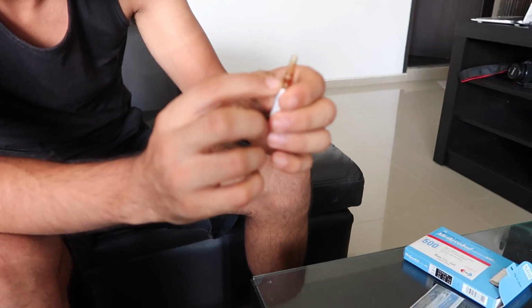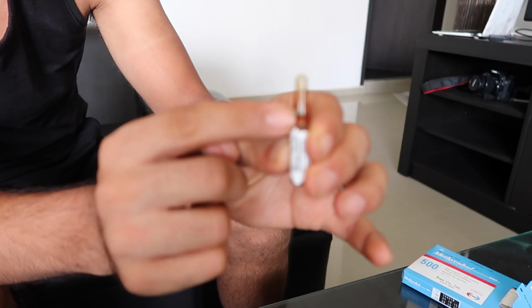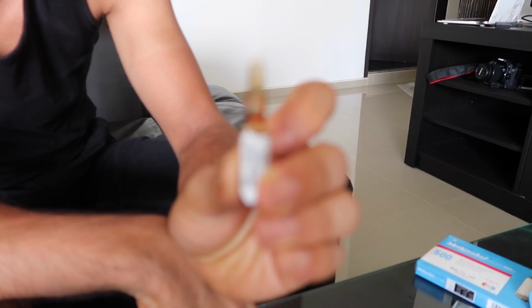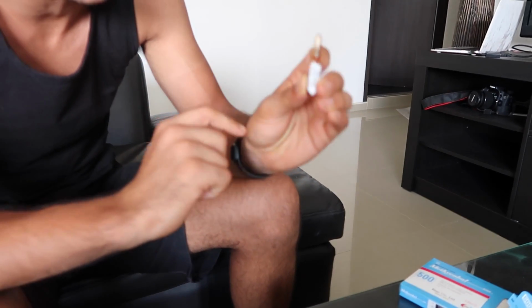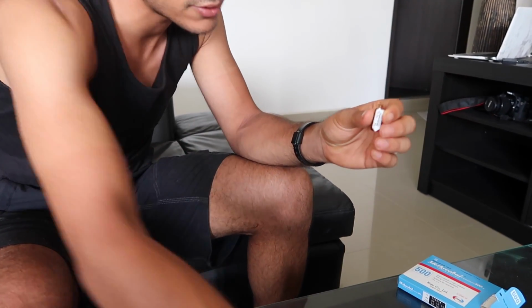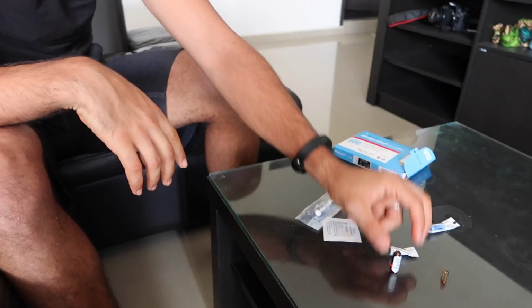And to open it, there's a green dot on one side. Wait for it. You see it? It's not focused, doesn't matter. There's a green dot. When you get one, you'll see it. What you have to do with this one specifically is put your thumb on the green dot, just bend it over, and it'll crack the glass, and you put it down. B12.